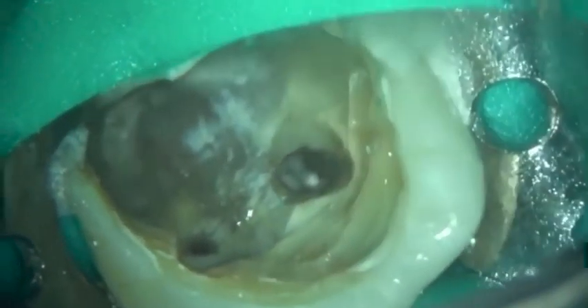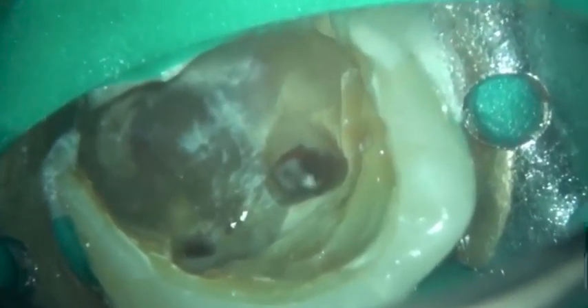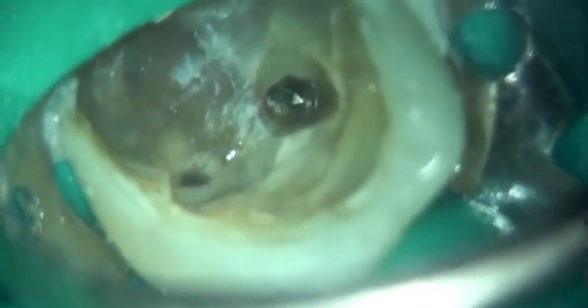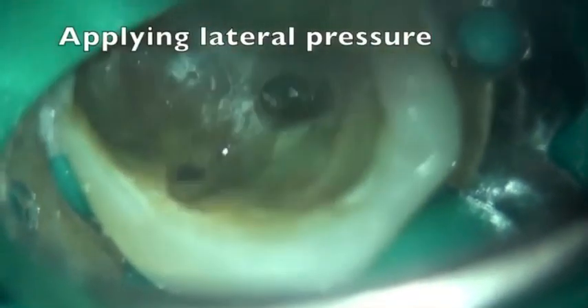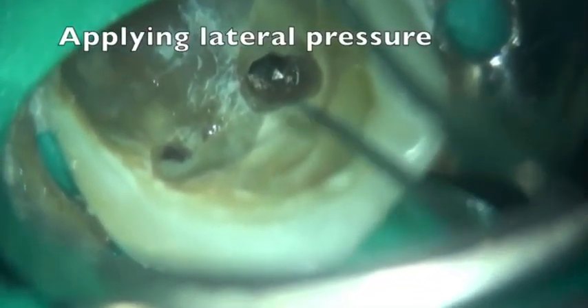High magnification shows the piece of broken instrument. Applying lateral force with the ultrasonic tip encourages the piece of broken instrument to unscrew itself.